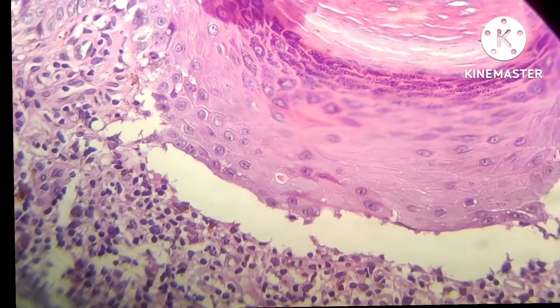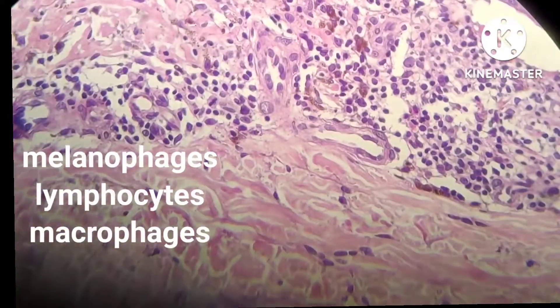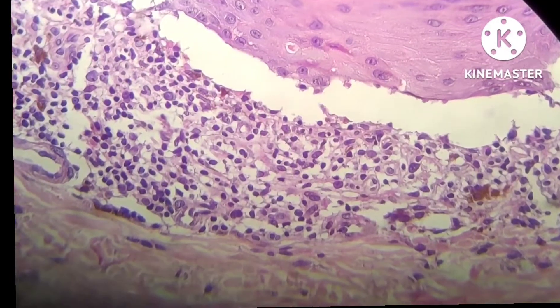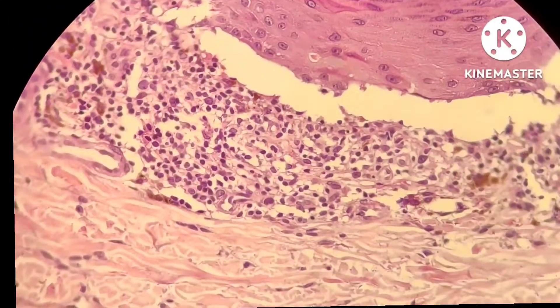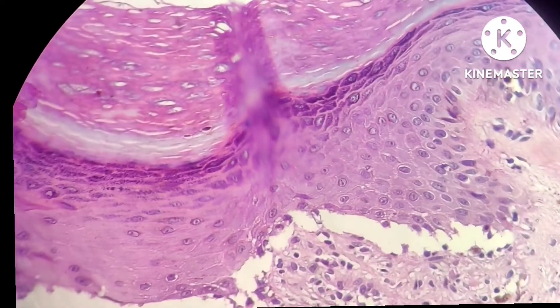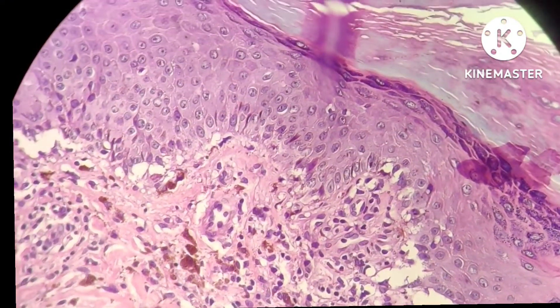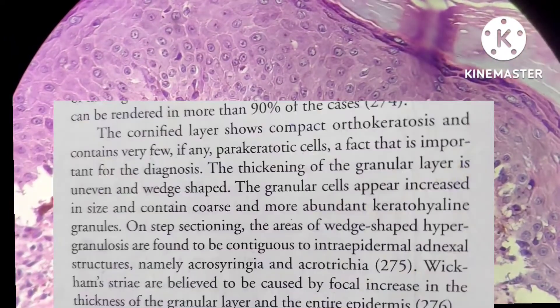These are necrotic keratinocytes, apoptotic bodies. They are usually present in the epidermis or in the upper part of the dermis amongst the inflammatory infiltrate. They may be present anywhere from dermis to keratin layer. You can see dense inflammatory infiltrate here. There is Max-Joseph space. All those small dark round blue cells are lymphocytes. Many melanophages are seen. Look at the arrow pointing towards basal vacuolar degeneration — we are not able to make out the basement membrane at all.